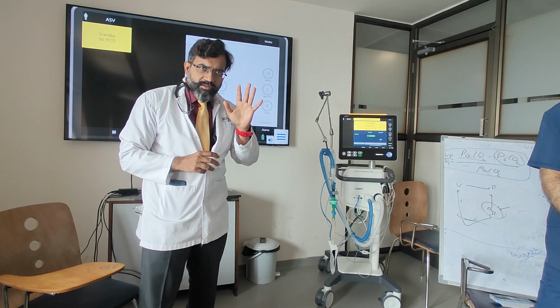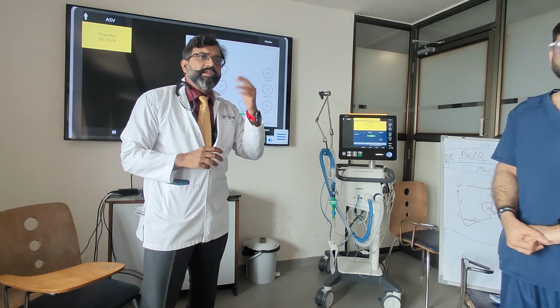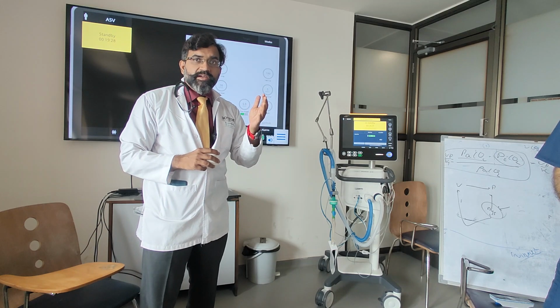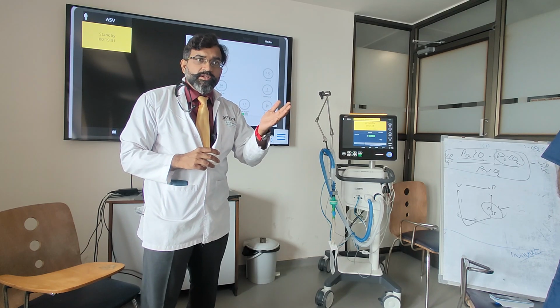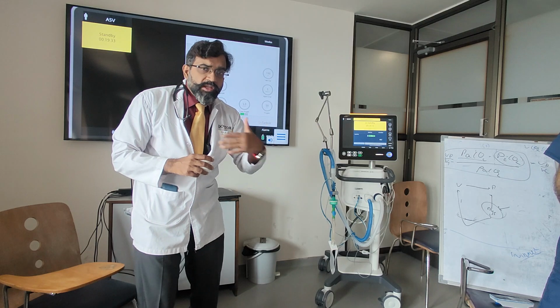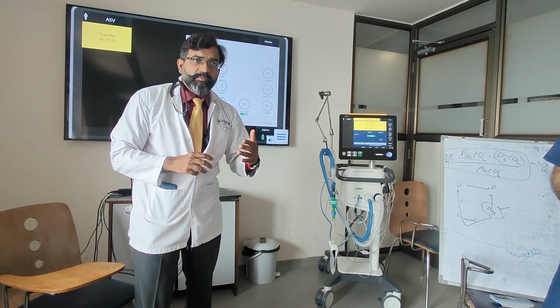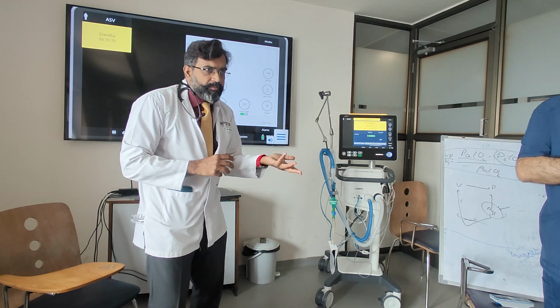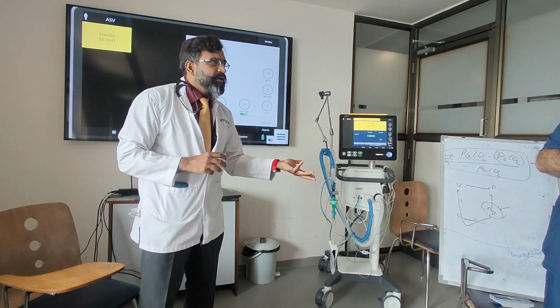Are you understanding? If I have a patient with hyperthermia, the patient has fever, acidotic, his metabolic rate is very high. So he is breathing at a high rate. We require the carbon dioxide to move out of that body very quickly, because it's a problematic metabolic problem. What do you do with that? Simple. So 100 maybe, maybe 120.